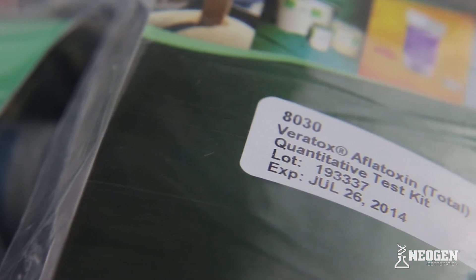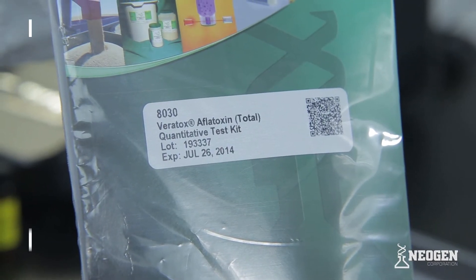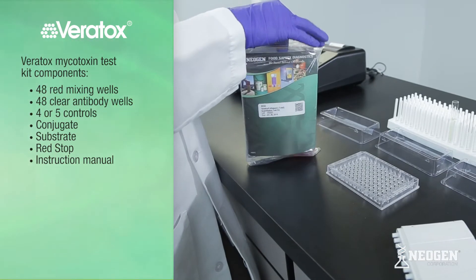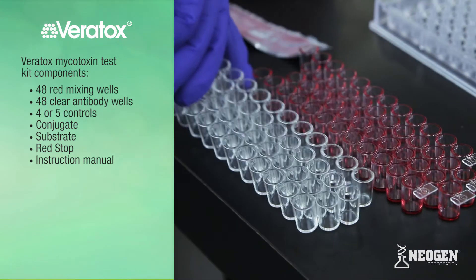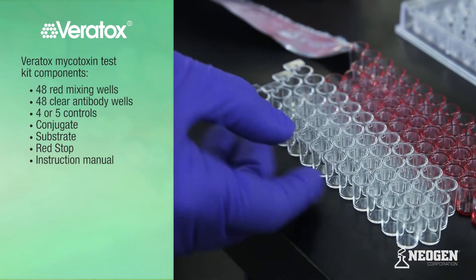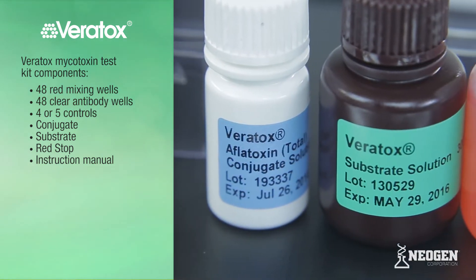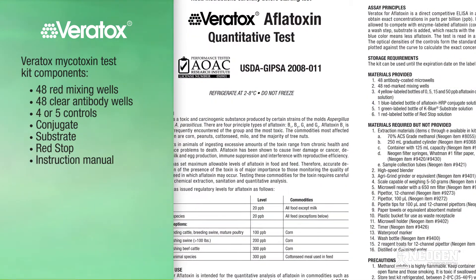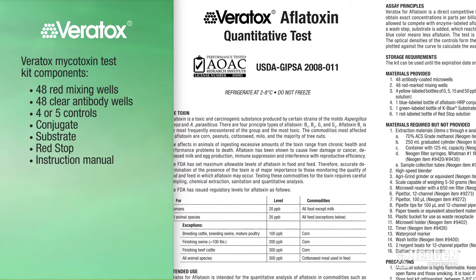For this presentation, we will be demonstrating Neogen's Veritox for Aflatoxin. All test kits are generally run the same, but exceptions will be noted where relevant. Each Veritox mycotoxin test kit contains 48 red mixing wells, 48 clear antibody wells, 4 or 5 controls, conjugate, substrate, red stop, and an instruction manual. The Veritox Fumonacin 510 and 1010 kits also include pre-filled dilution bottles.